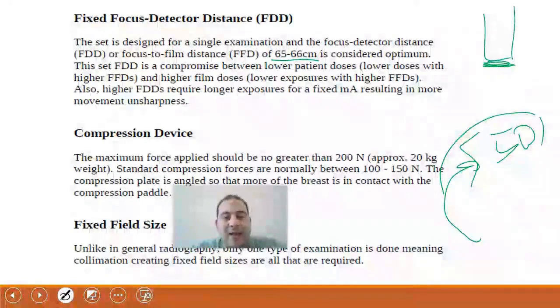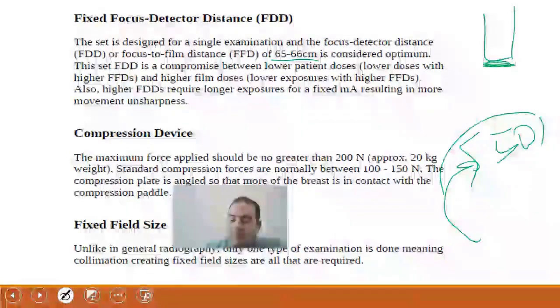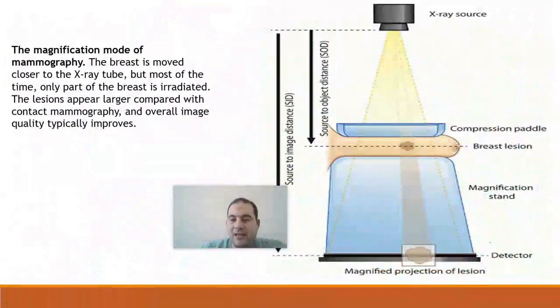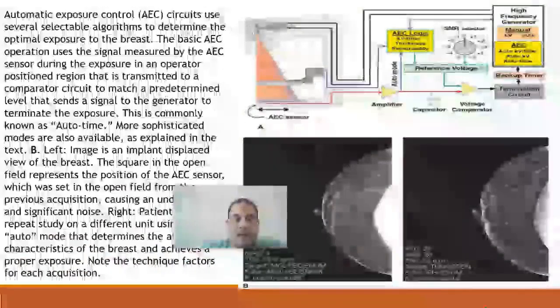So the idea is that you need to choose the right distance, and in some cases, of course, if you are doing something specific, the magnification process is crucial, so you carefully choose your platform, which serves as the magnification standard, and it is imaged through it in a detailed manner with precision and care.